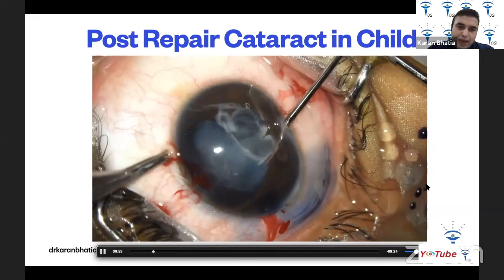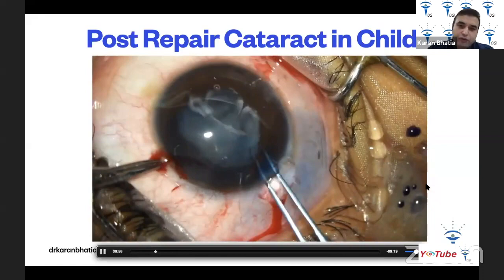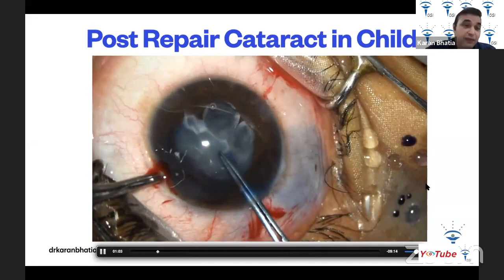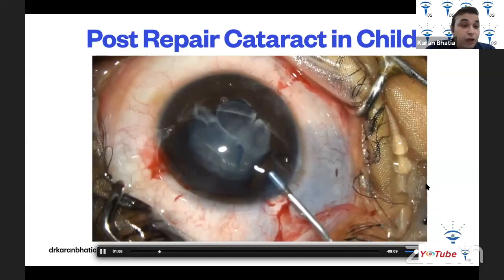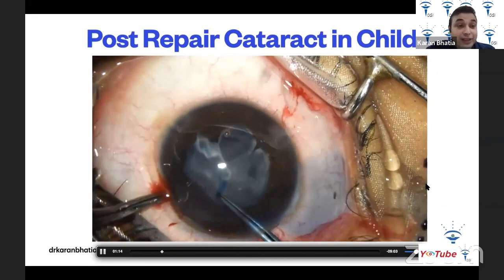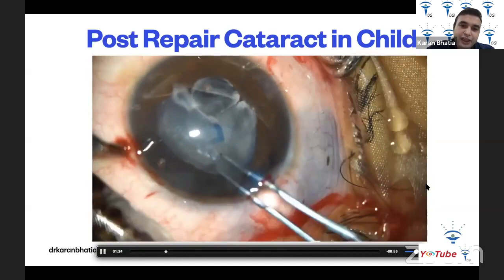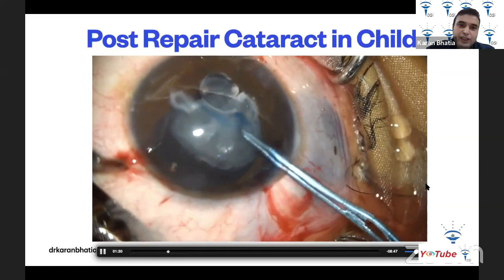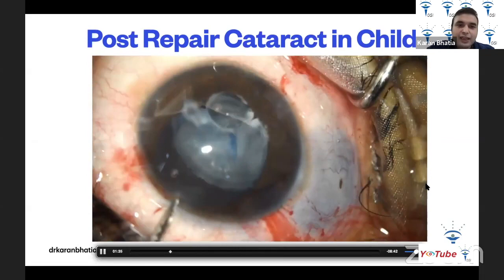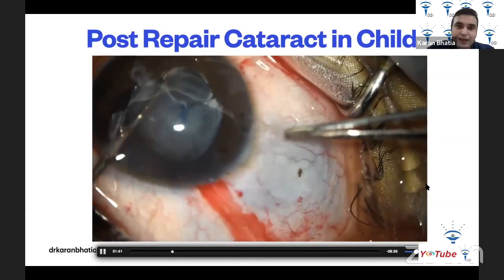Converting the anterior capsular tear into a rhexis using Haldipurkar forceps. Pediatric eyes behave very differently from adult eyes — you cannot take the rhexis to the outside but must pull it toward the center, otherwise it will result in an extension. This is a key difference in performing rhexis in pediatric versus adult eyes. It is a very slow maneuver with repeated viscoelastic injection. Fibrotic areas require micro scissors to cut through.